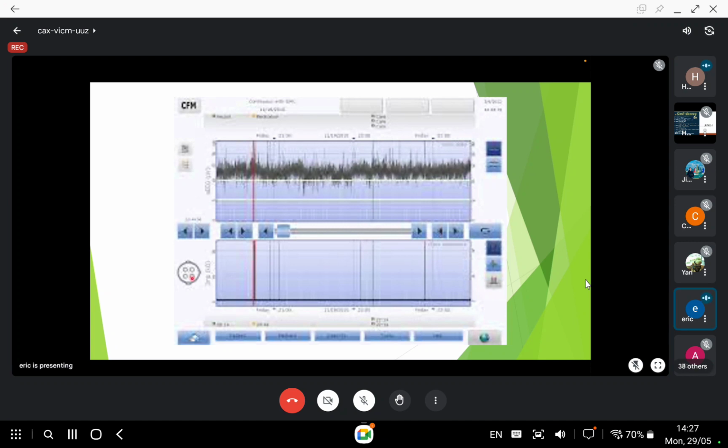Okay, first of all, what are you supposed to see? You just go through the steps. Number 1, the impedance. This is 10. So this is a good impedance, right? Yes. Okay, secondly, we look at the background activity. Where is the lower limit? Is it above 5 or below 5?